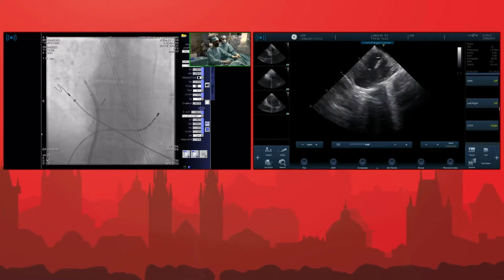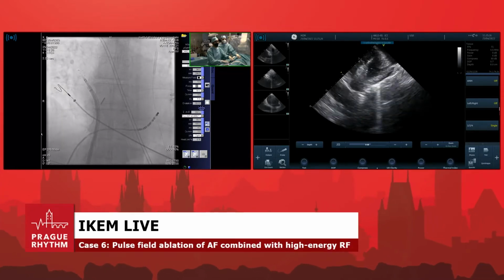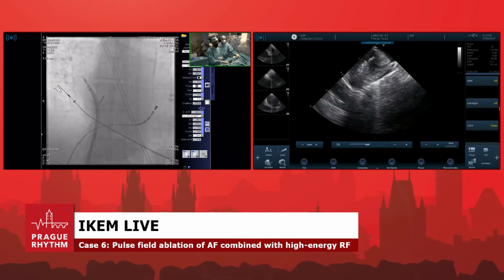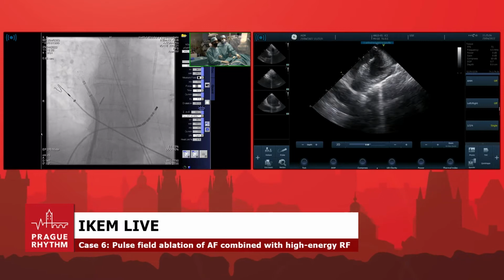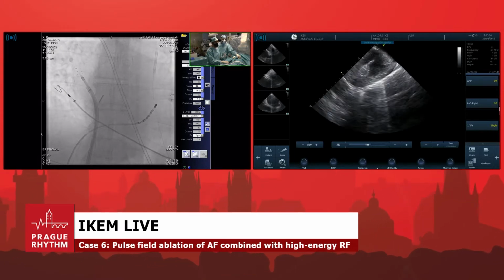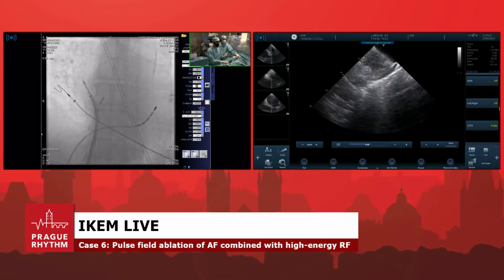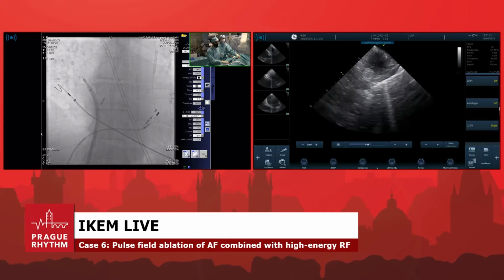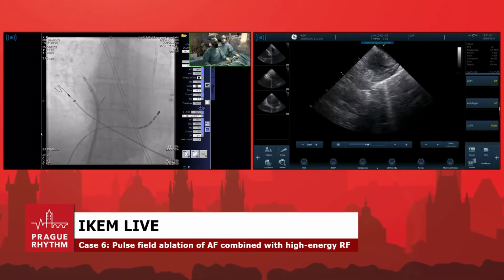Can you go a little bit slower? Here you go. I'll take it out a little bit, and you can see the catheter, how nicely it is recognized, and you can see the right superior vein os. So we can correlate what we do in the electroanatomical map with ICE, and the correlation has been excellent, which suggests that the mapping is very, very accurate.